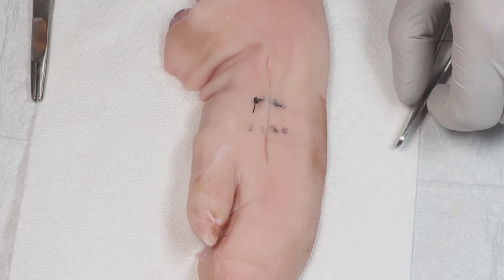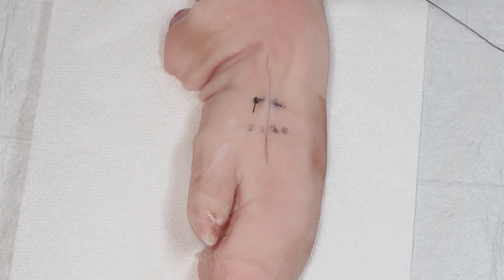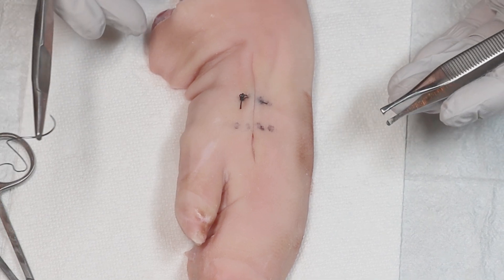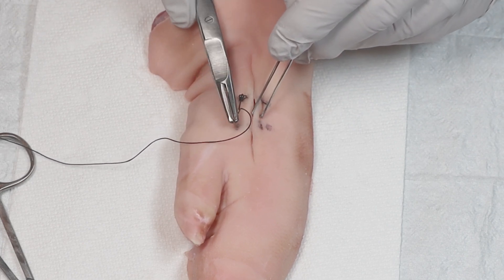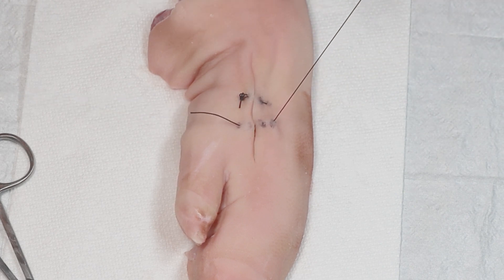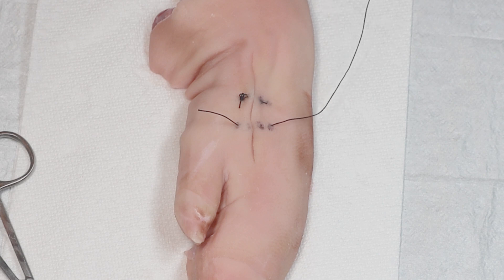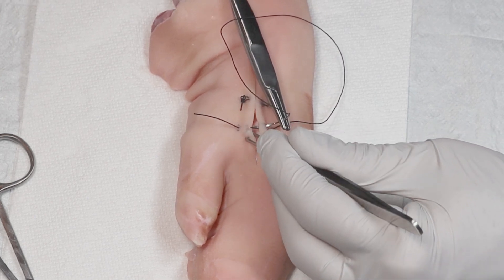Let's do another. One thing that's important to know is that your bites have to be symmetrical, especially the depth of the near, near loop — where the skin edges misalign, it could heal with a noticeable shelf on one side. That's important to know. So here we go again. We're going to go far, far, going relatively deep, coming out very symmetrically right across. Reload going the other way and make sure you have a nice short end there. Now we're going to go ahead and go near, near, and shallow.